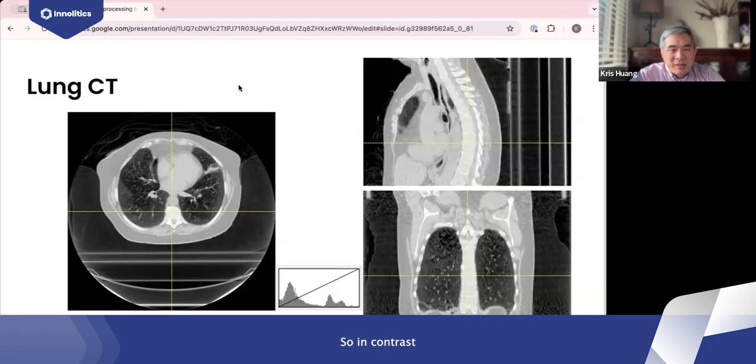So in contrast to how we probably have seen CT images, you can see almost everything in here. You can see the lung tissue pretty well. You can see the low density padding that the patient is kind of squished into. But you can also see the soft tissue. It's not the best contrast, but you can see okay contrast between the fat and the muscle.